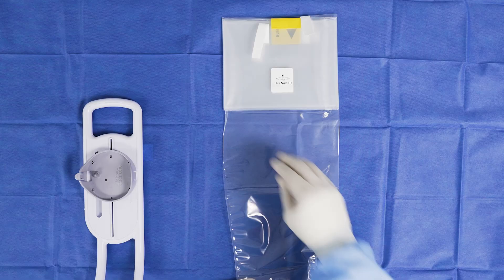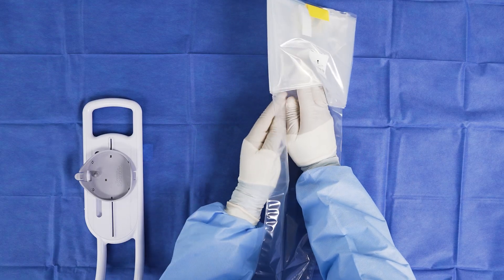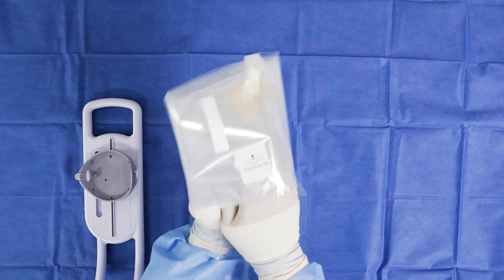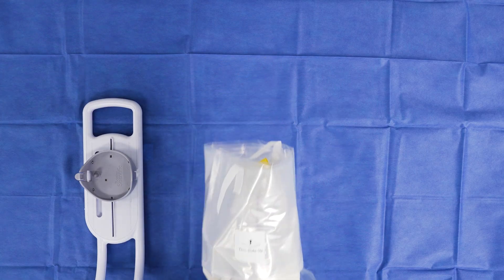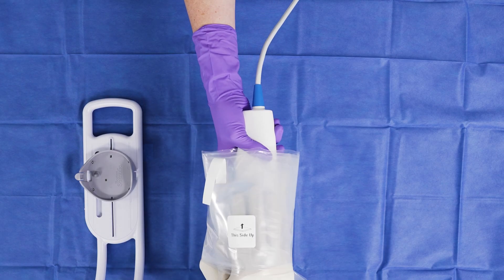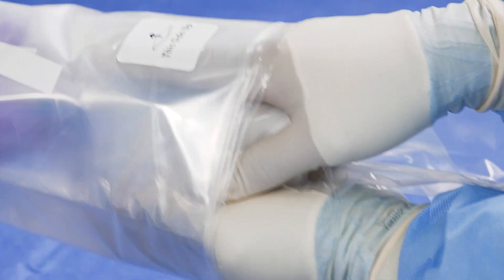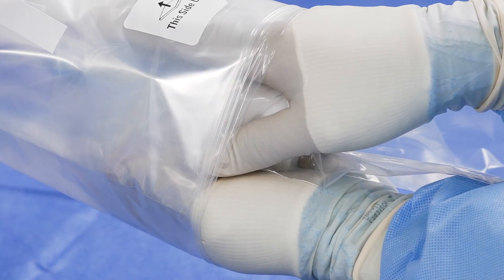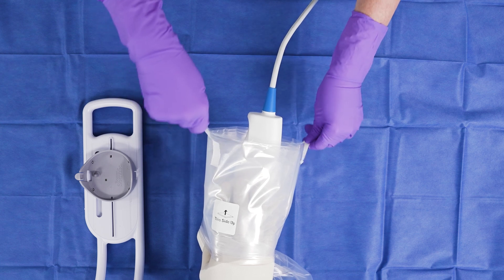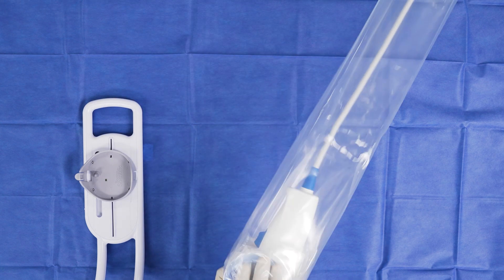The sterile operator should then slide their hands into the most inner folds of the sterile bag. Have the non-sterile operator place the MDU into the innermost fold of the bag, aligning it with the 'this side up' sticker. The sterile operator will grab the MDU and ensure it is secure in their hands. Using the white strips, the non-sterile operator can then unfold the bag to its full length, covering the cable of the MDU.